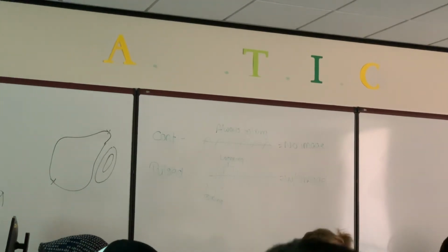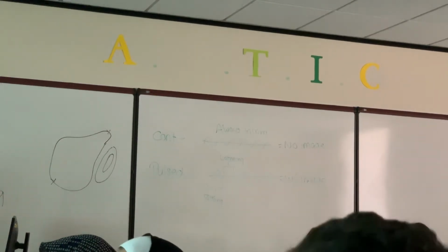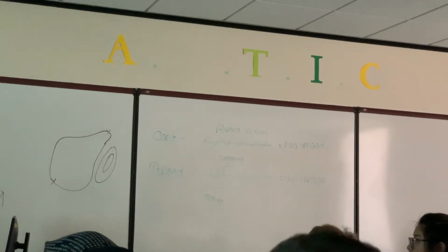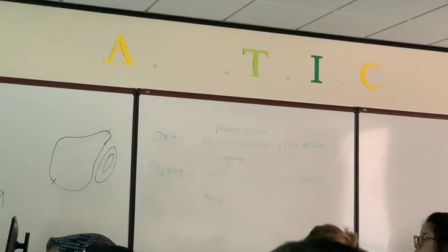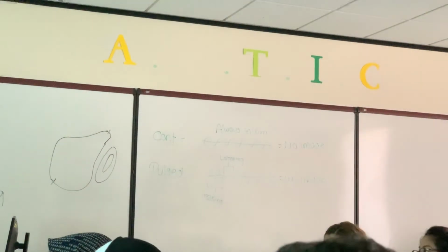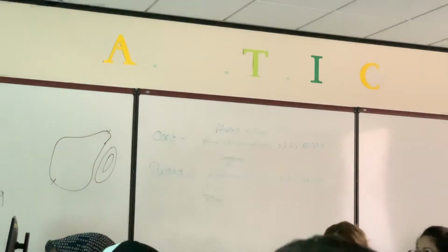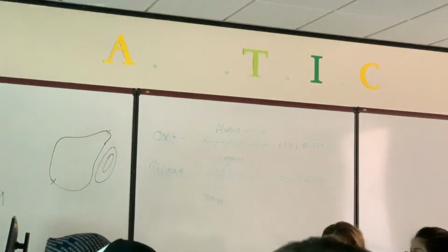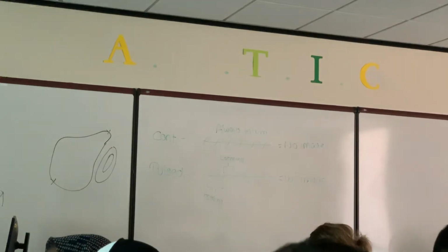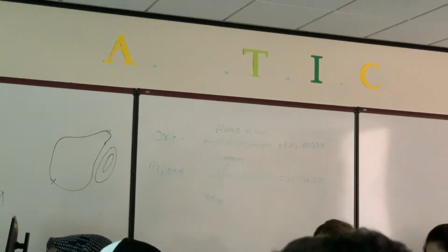Okay. We're good, guys, when we're talking about pulse ultrasound? Again, remember, for pulse ultrasound in diagnostic ultrasound, it's going to be 2 to 4 cycles. That's going to come into play when I talk about the next thing, which is pulse duration. Pulse duration actually tells you what it is in the definition. Similar to the period, the period deals with time as well.